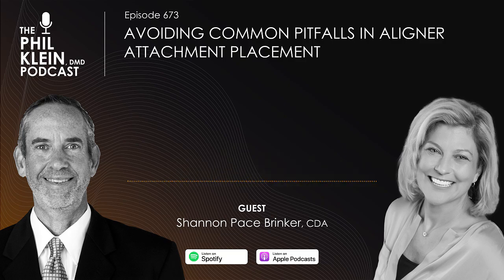Now, before we do that, Phil, one of the things that we miss, this is a huge perk. This will probably be the third or fourth tip we've given you on this podcast. First of all, I like to clean off that attachment area. The one thing that is similar to brackets and wires is that they're wearing these 22 hours a day, 7 days a week. We want to take it out and eat, do whatever you're going to do, put them back in. But a lot of times people don't brush right after. And now you've got this biofilm stuck underneath this aligner. That's critical, because this is where the white spot lesions come into play. We've got to be careful here.